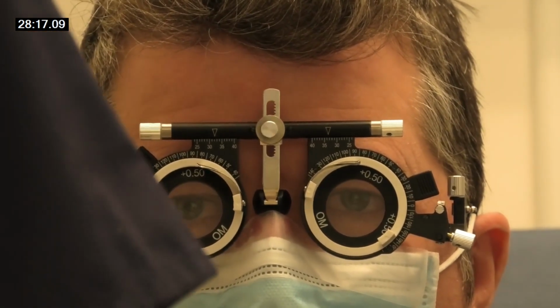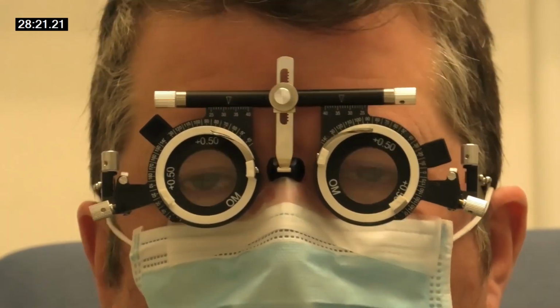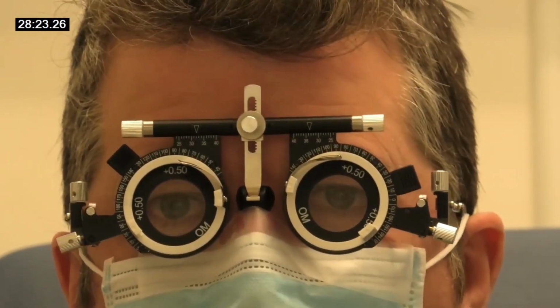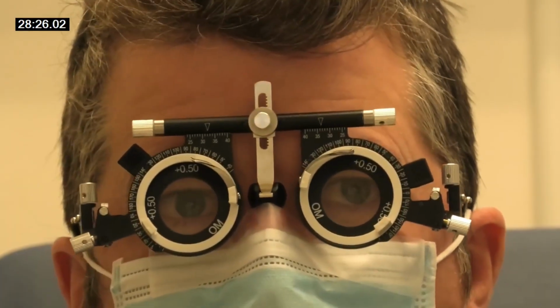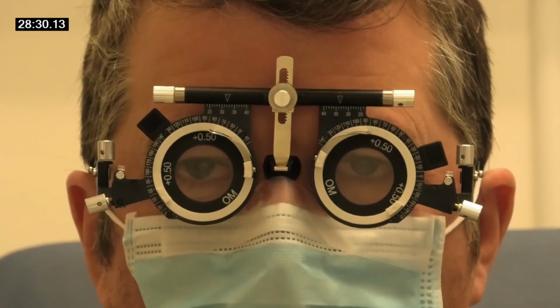And that's the final subjective. Yeah, well, you can put it in the subjective. It will be our final one as well. Okay. And then we just need to see how close he can get it, how much accommodation he's got.